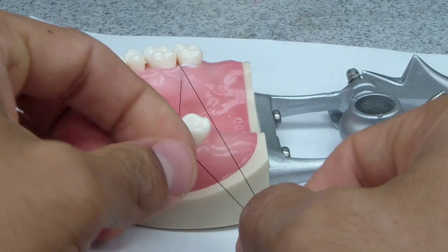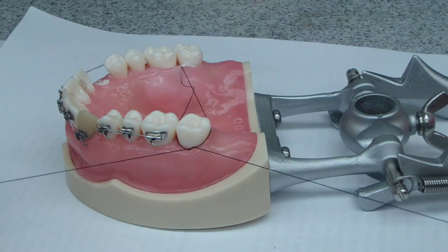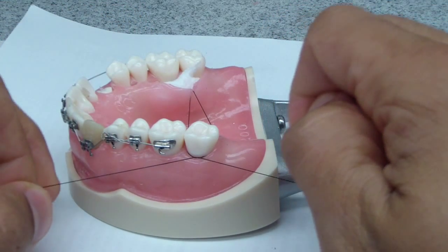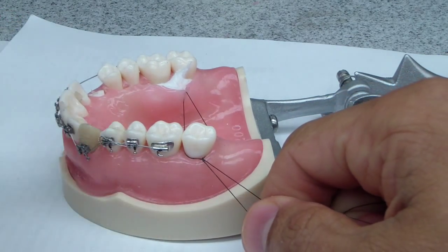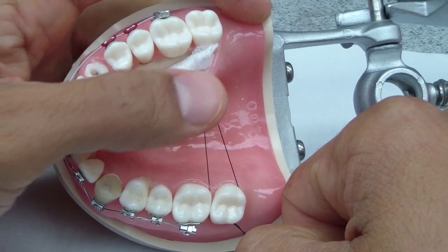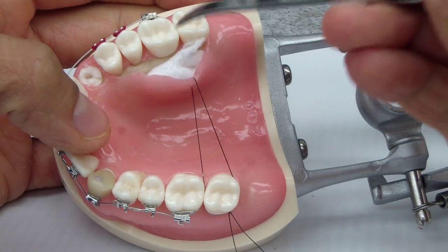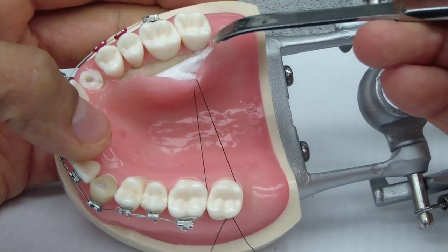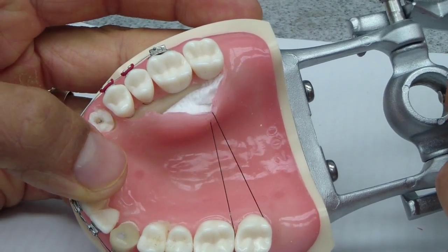Just like that — tie it off in a knot and off you go. Another technique, but you've got to make sure you don't tear your flap. So we were just talking about quick ways to maintain the flap elevated when you're doing procedures such as implants, crown lengthening, or even open flap debridement. I hope that helps. Cheers.